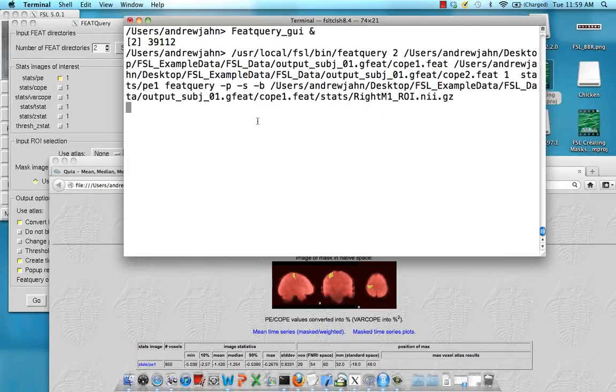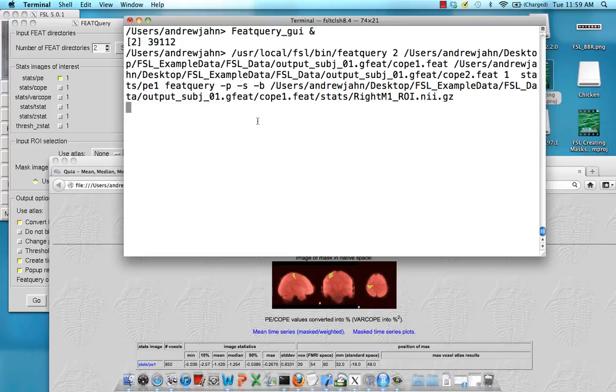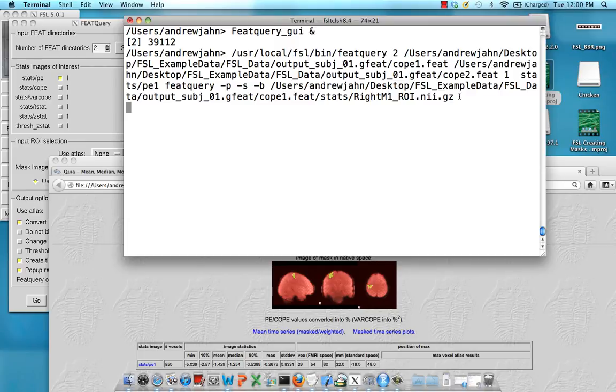Last thing you should recognize is after you've hit go from the FeatQuery GUI, you get this output of text that you can use as a command line in case you want to script your FeatQuery analyses for more regions of interest or more subjects.